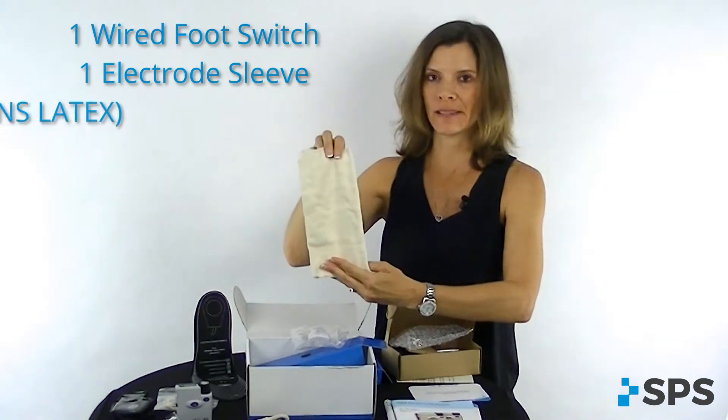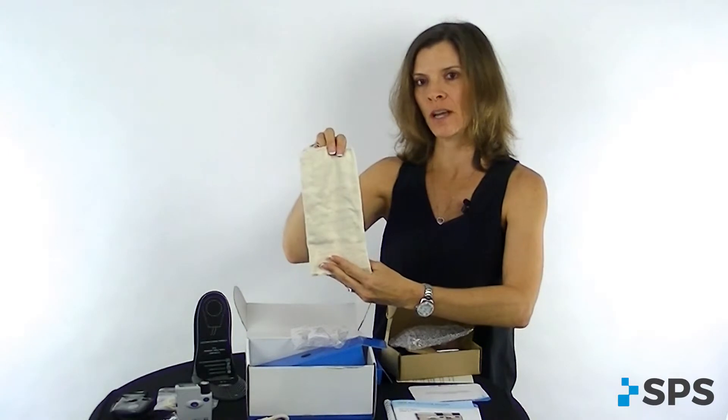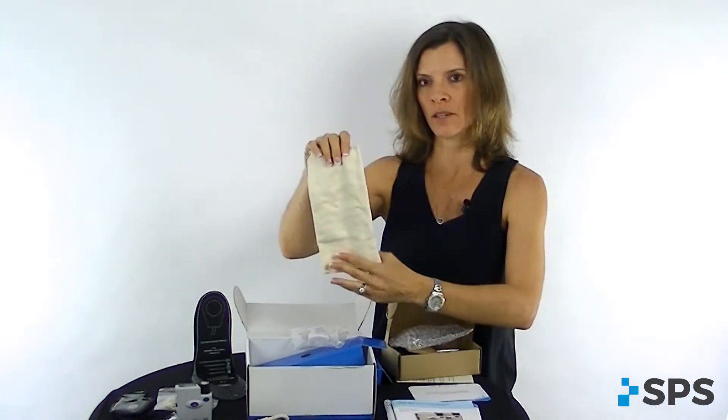Something that you need to know: the sleeve does contain latex. So if your patient has a latex allergy, please make sure that you have an alternative option for them.